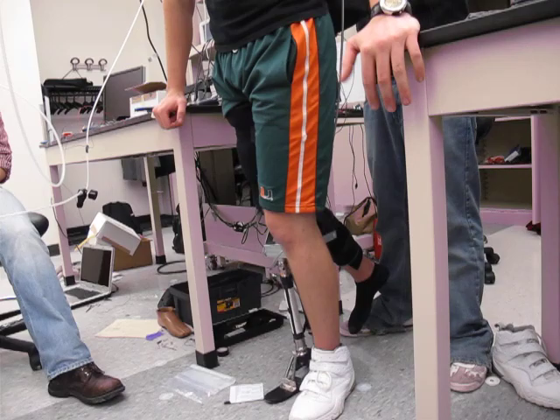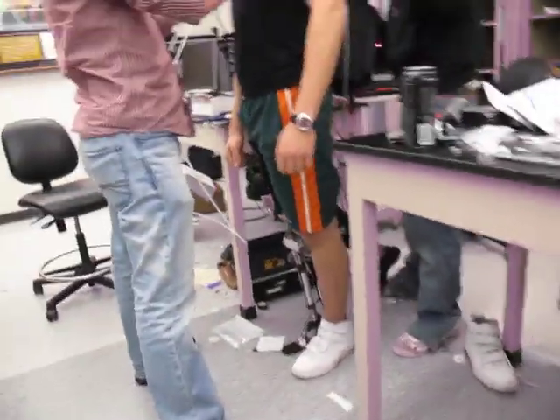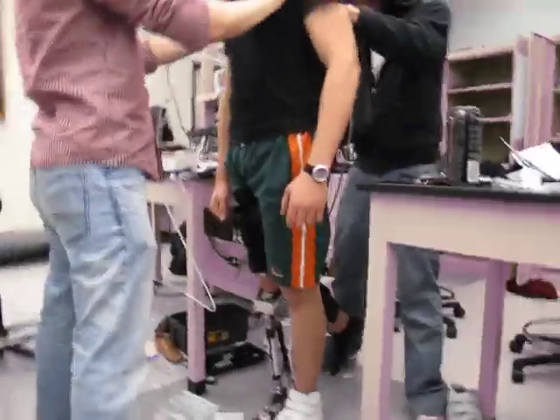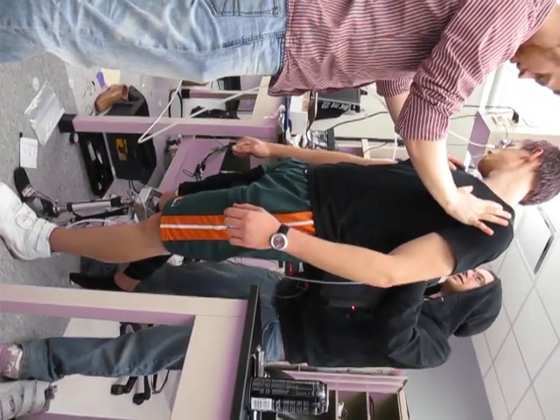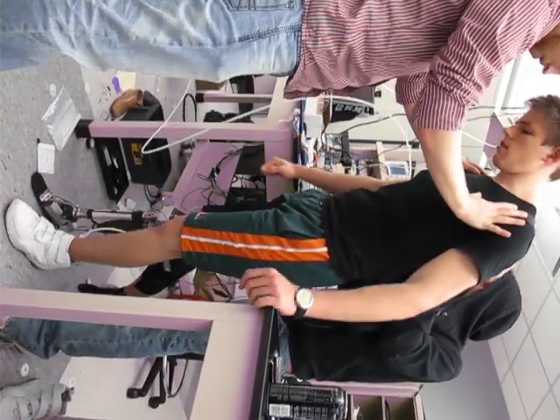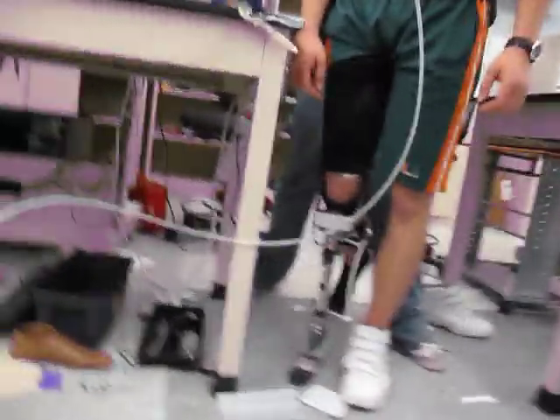How much weight do you have on your arms? Let's just do this — you guys come here and grab one of my shoulders. I'll make sure you don't go anywhere. Ready? There's only contact. I'm gonna lean harshly back to myself. What's the voltage range right now? Sideways — we'll do corners. And it's just amazing how... you're gonna need to be a little bit more. Get ready.